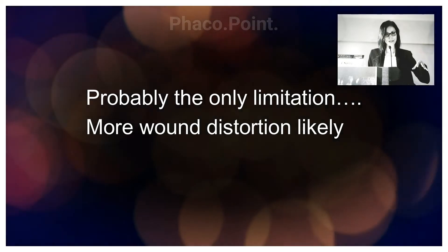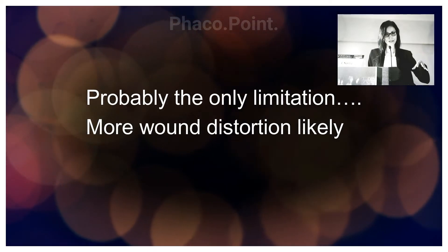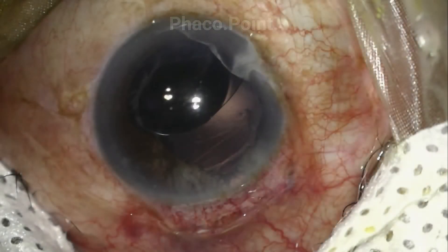This is to minimize the damage to the corneal main incision. This patient presented on day one postoperatively with an inferiorly decentered IOL.